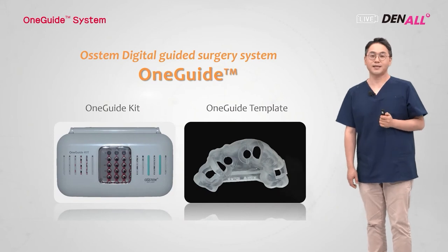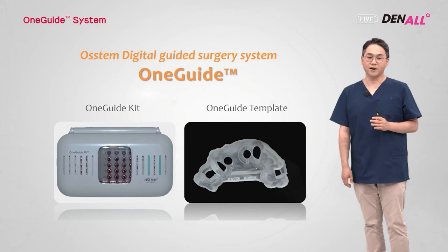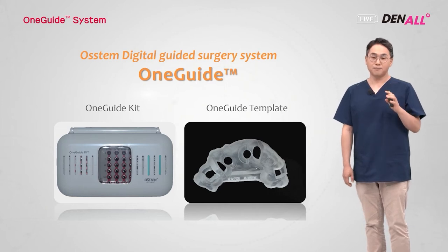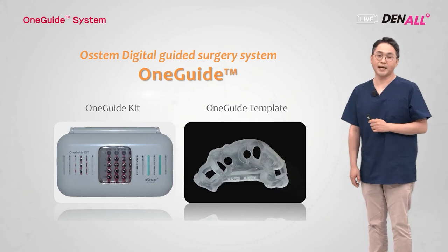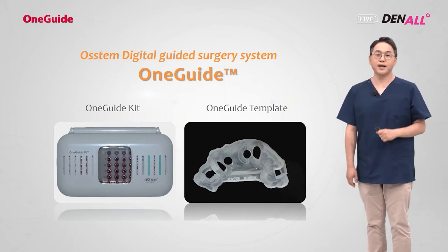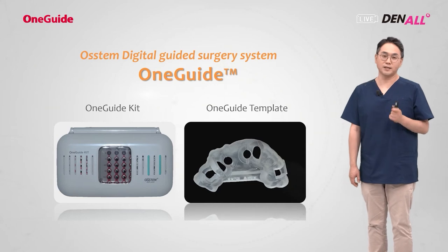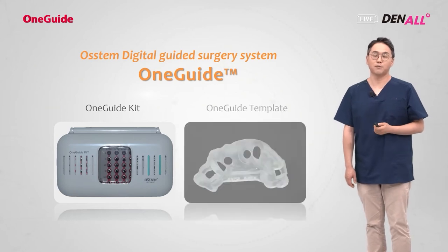We looked at the OneGuide template that does not have the metal sleeve, and the surgical template guide hole offset is 10.5 millimeters, which is a single dimension. To drill for and place an implant through the guide hole on the OneGuide template, a dedicated kit is used. Let's look at the OneGuide kit.